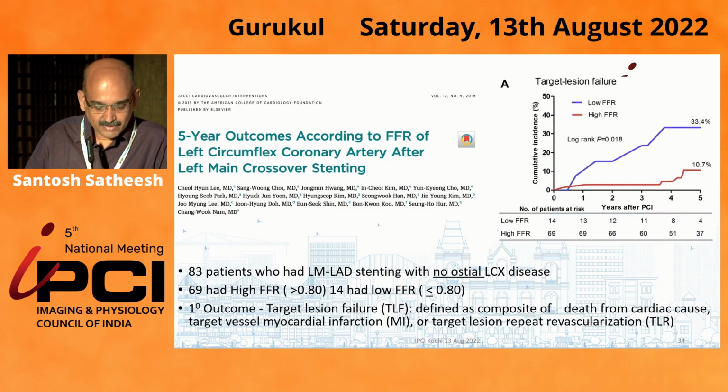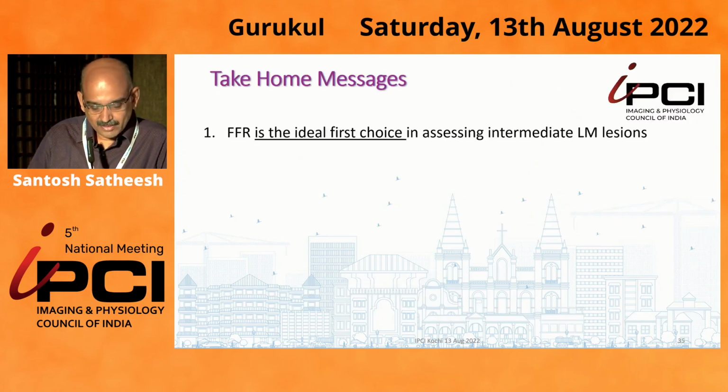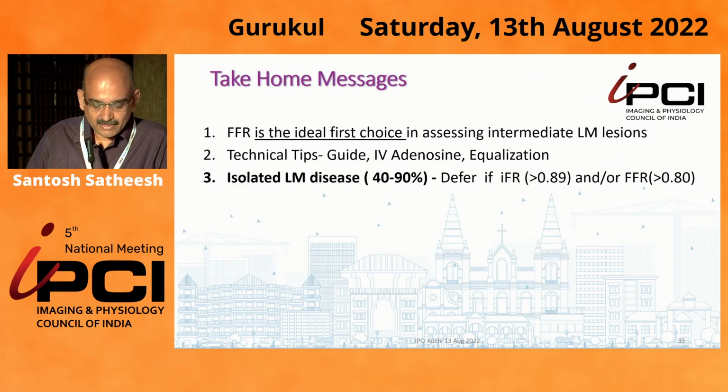This 5-year result shows that it is safe to defer even if it is looking pinched, but FFR is normal. So the take home messages are: FFR is the ideal first choice in assessing intermediate left main lesions. Technical tips have to be carefully looked at.